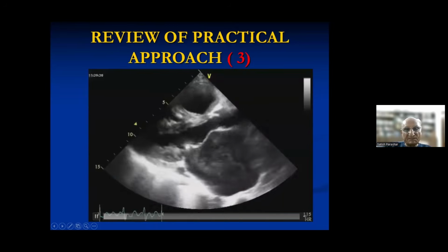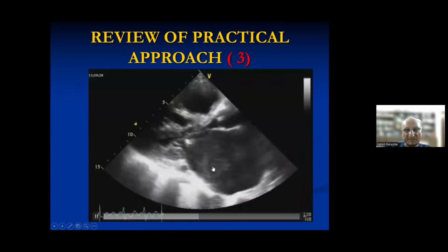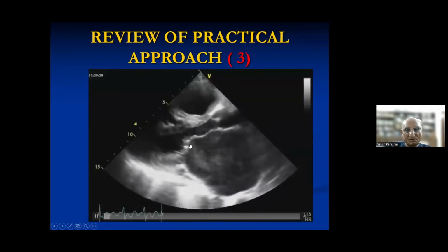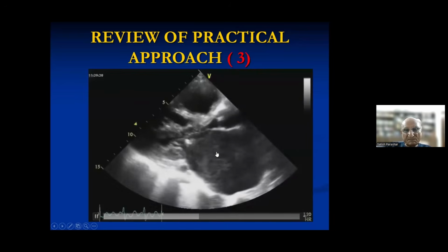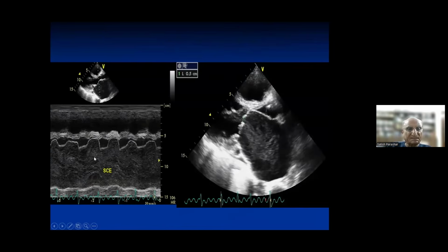So see the anatomy, the RV may be enlarged, LA is enlarged, but three things mainly you want to see: what is the opening index of the mitral valve, whether there is a clot present or not, and that is the thing. And this is only for our clinical interest what we have taken. Wherever you put an M mode cursor in a 2D echo, you get the same thing.